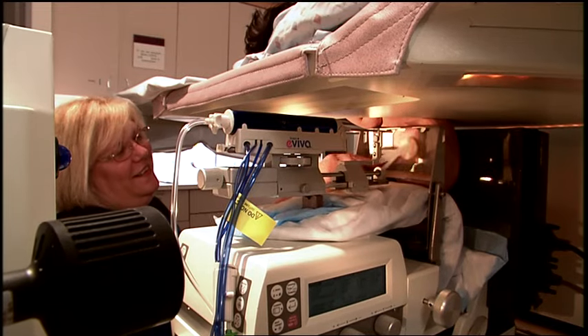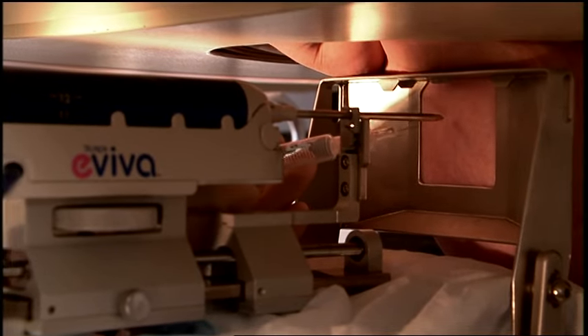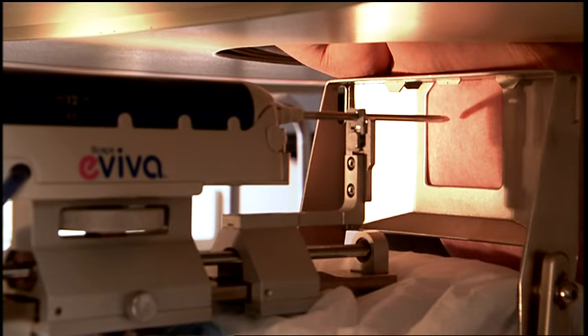The technologist cleans the breast with an antiseptic solution. To make the patient more comfortable, an anesthetic is injected into the skin at the biopsy site and into the breast itself.